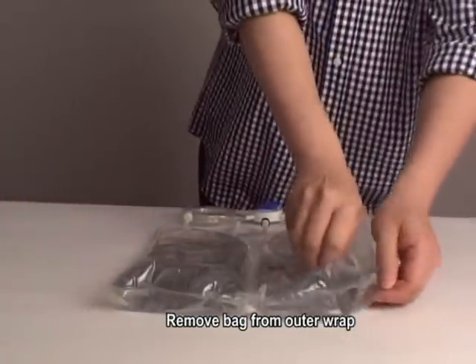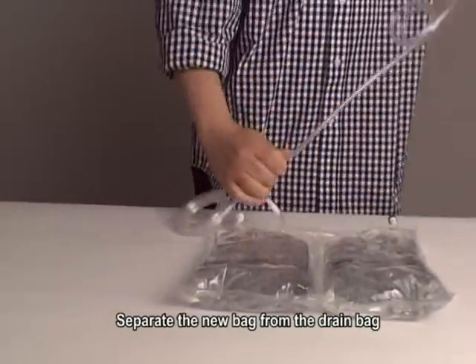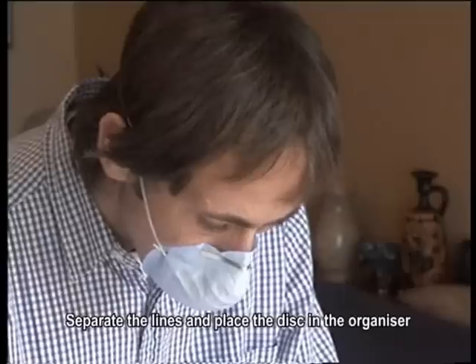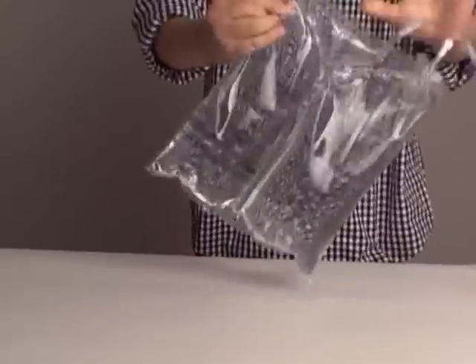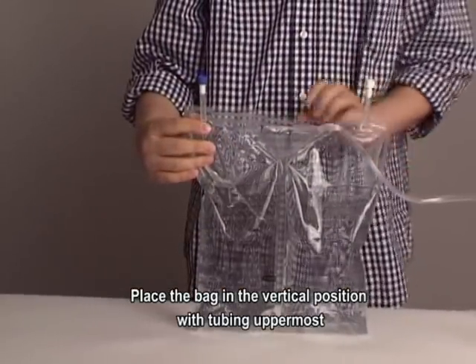Remove the bag from the outer wrap. Separate the new bag from the drain bag. Separate the lines and place the disc in the organizer. Place the bag in the vertical position with the tubing in the uppermost position.